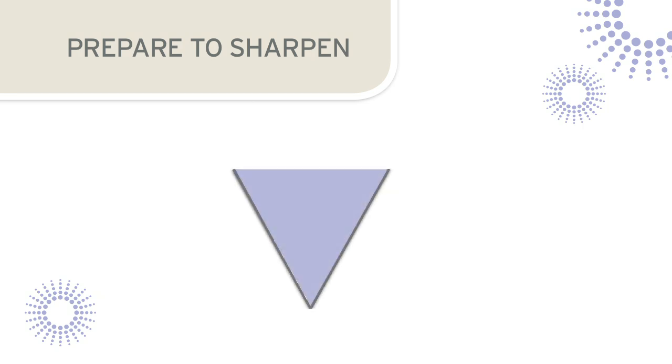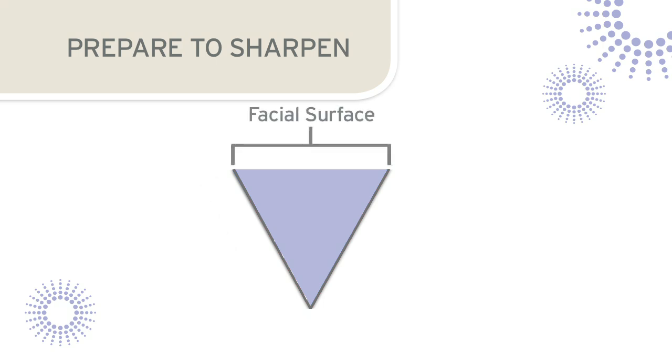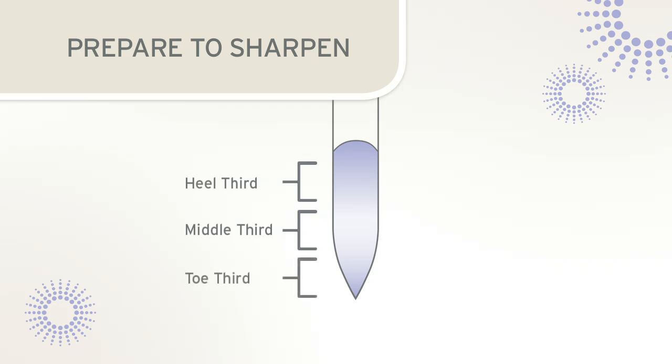During sharpening, the cutting edges will be restored by grinding against the lateral surfaces of the blade. It is not recommended that the facial surface be sharpened, as this can weaken the blade. When sharpening a sickle scaler, the entire length of the blade should be sharpened. This includes the heel, middle, and toe of the blade. When sharpening, the stone will be moved along the blade edge from the heel to the middle and finally to the toe of the blade.